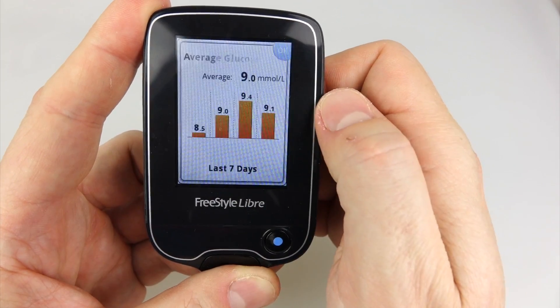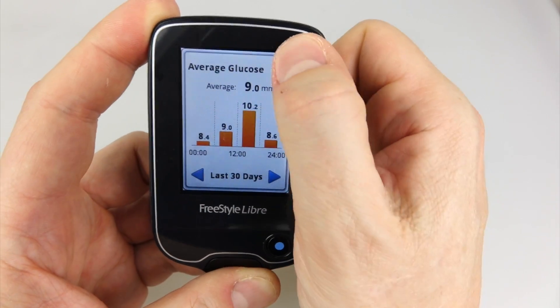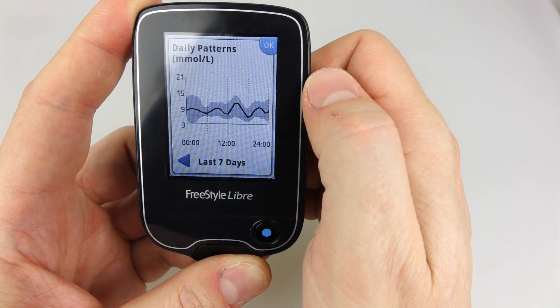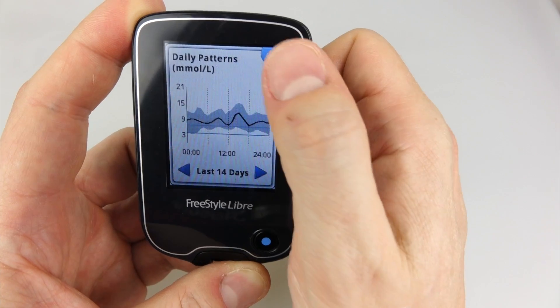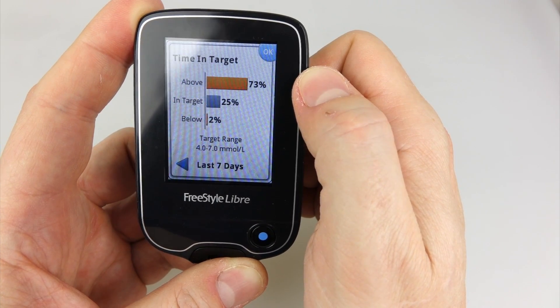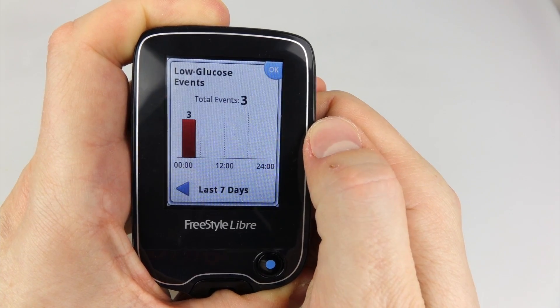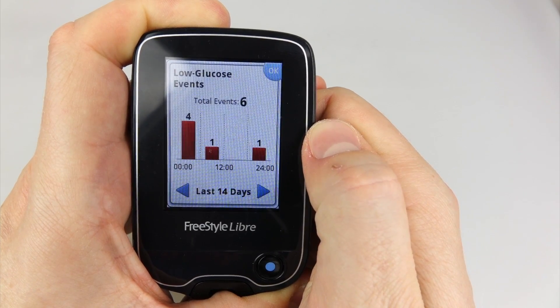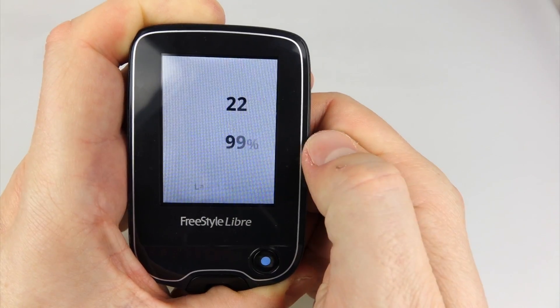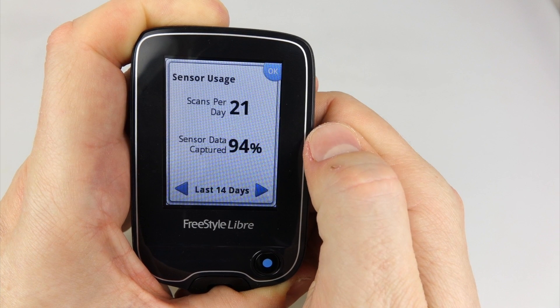In a way it gamifies the whole diabetic process — there's a compulsion to try and improve your score. Obviously 9.0 is not a good average glucose. My HbA1c from the doctor the other week was 7.1, so I'm going up a little bit and need to work on that, but I've got the data here to show me what parts of the day I'm going wrong and what I need to do to correct it. The time-in-target was above 73% of the time. There are also low glucose events — those slightly worrying hypos while I'm sleeping. And sensor usage shows 22 scans a day, which there's no way I could do with a traditional meter — I'd run out of test strips very quickly.